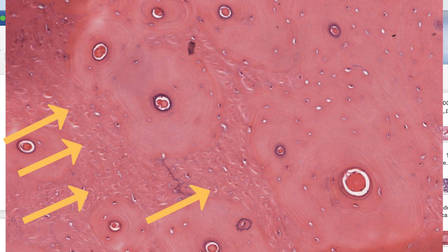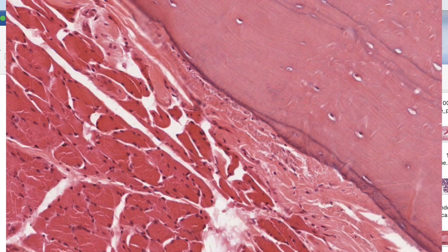In parts of the bone you can see the cross-sections of these collagen bundles as small, red, circular structures about the size of the osteocyte lacunae. The bundles run through the bone and have shrunk during fixation, so that one sees the lacuna as a white halo around them. Sharpey's fibres also anchor the periosteum to the surface of the bone.